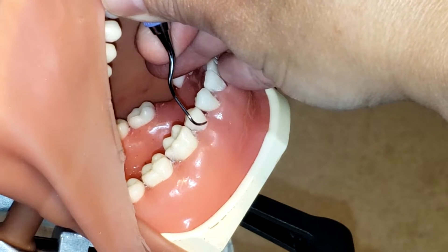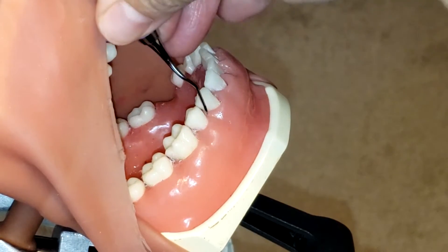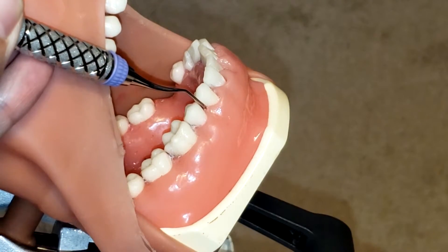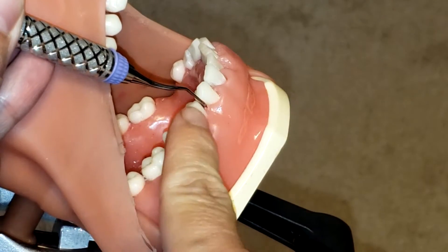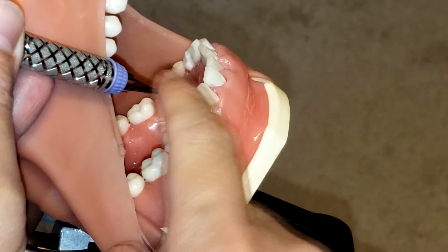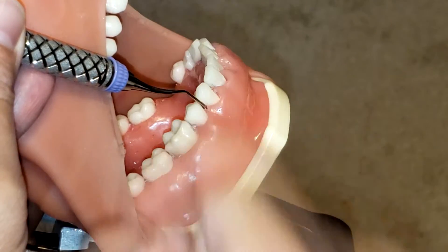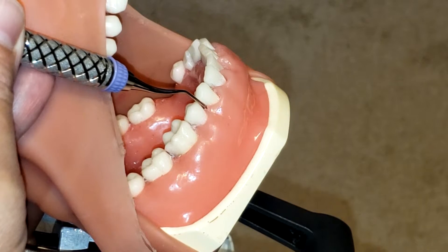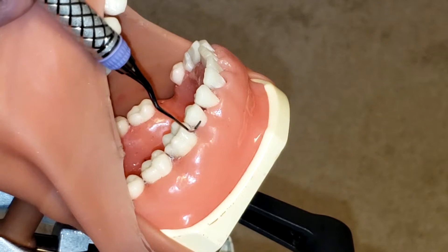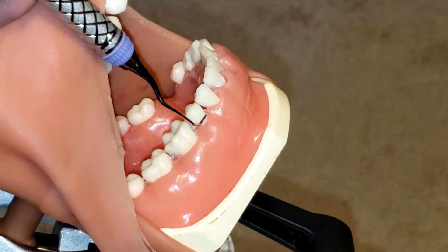It also hugs the mesial — if you put it on the face of the tooth it's going to hug the mesial. Now if I place the wrong working end, you see that the handle tilts incorrectly, and though the lower shank is parallel to the long axis of the tooth, you don't get that V going toward the distal. Instead, the V points toward the mesial of that first premolar, which is incorrect. If placed on the face of the tooth, the tip points outward — also incorrect.